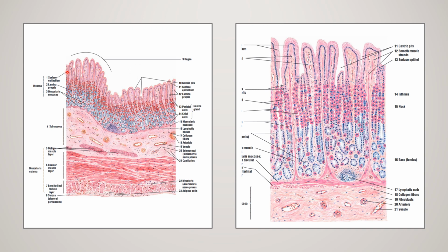If you take your stomach, the main function of stomach is secretion. So it is made up of simple columnar epithelium. That you have to see here. This is high power. You are able to make out that simple columnar epithelium. So stomach is lined by simple columnar epithelium. That is the lining epithelium. Here the main function is secretion. You will be having secretion of mucus, very thick mucus, that will cover the entire inner surface of the stomach.